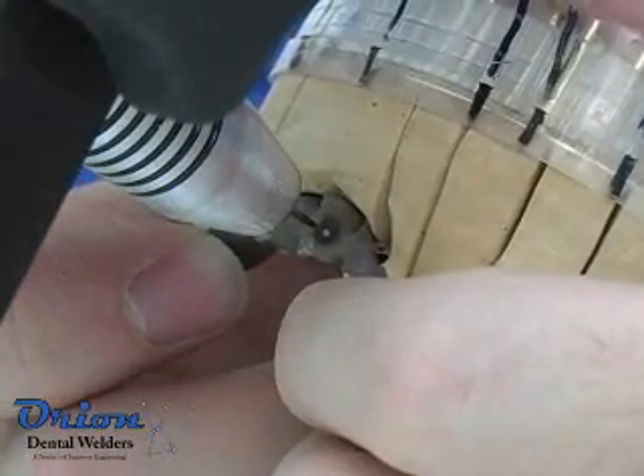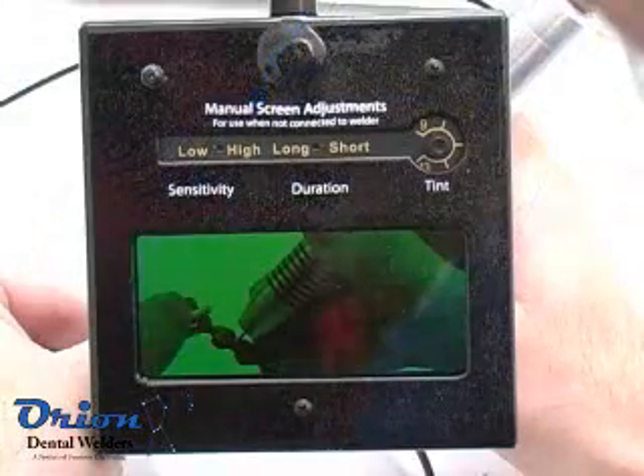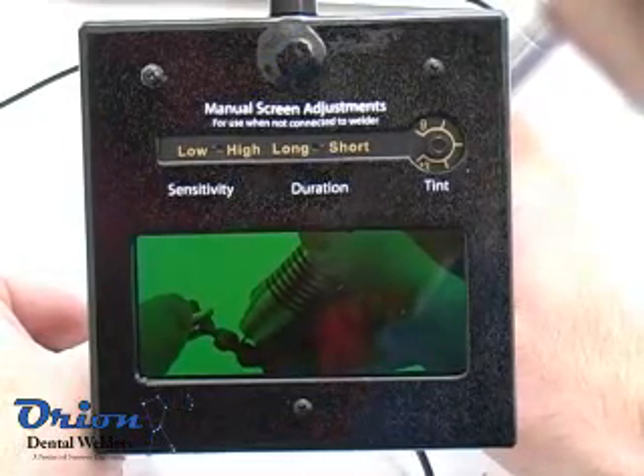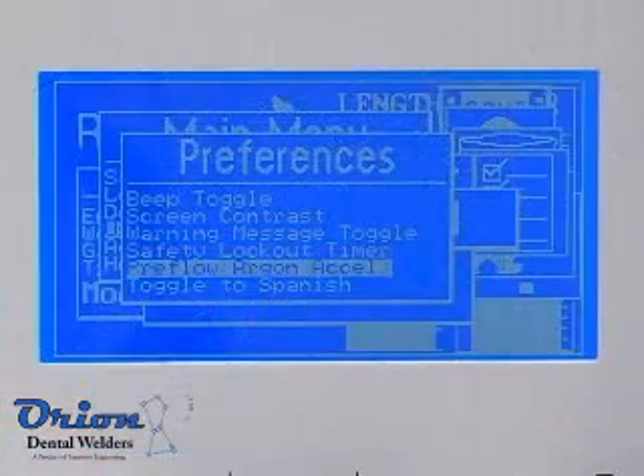When welding by hand, continue to use light pressure during the welding process. Always protect your eyes. The Orion will pre-darken an auto-darkening lens when plugged in.